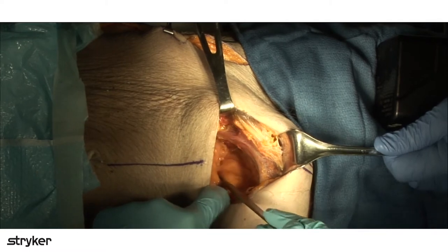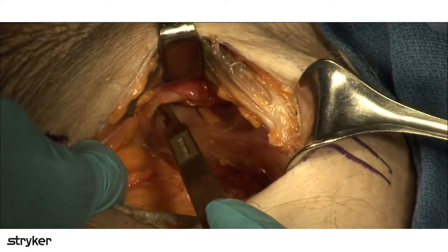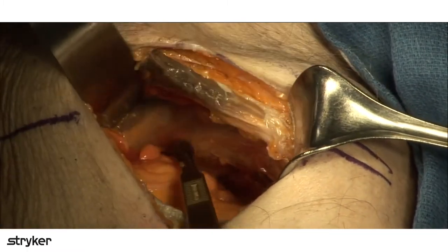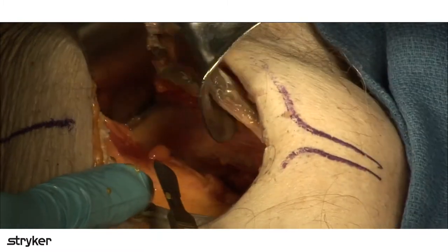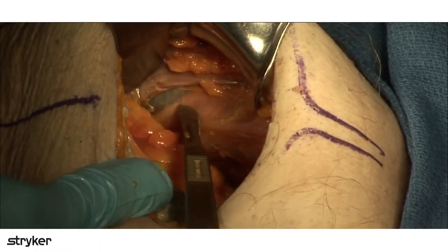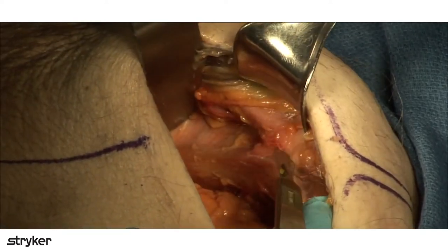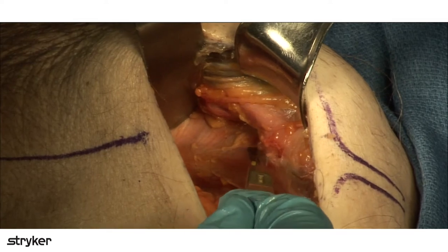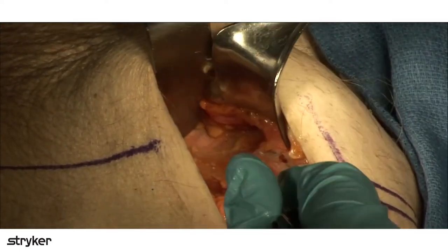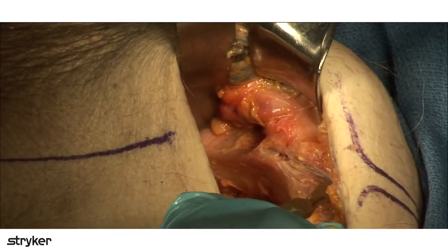We're starting in the true pelvis, and the only way for us to get into the false pelvis up here, and take a Deaver and just retract that up, the only way for us to get from the true pelvis into the false pelvis, is to release this iliopectineal fascia right here. All right, so I'm going to come along like this, and I'm going to carry that incision and continue it to what I'm doing with the rectus muscle.